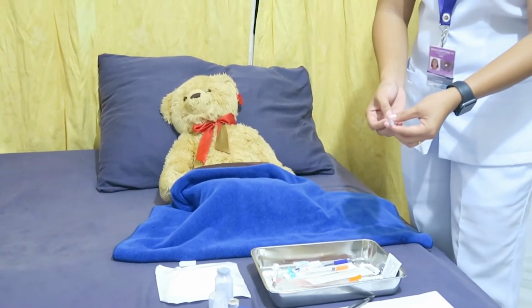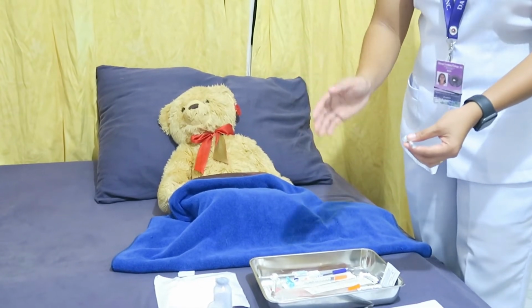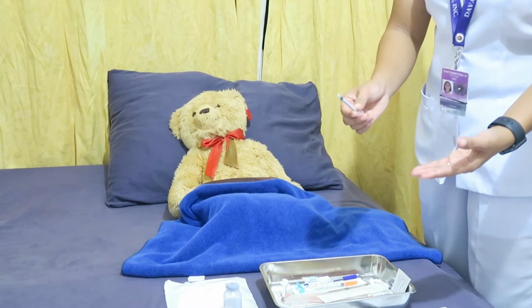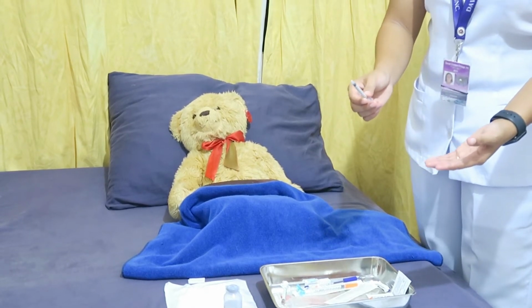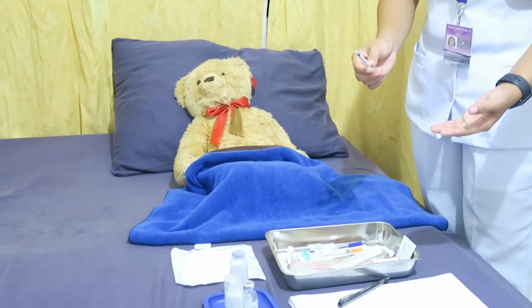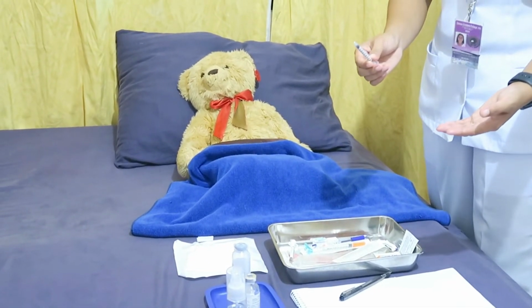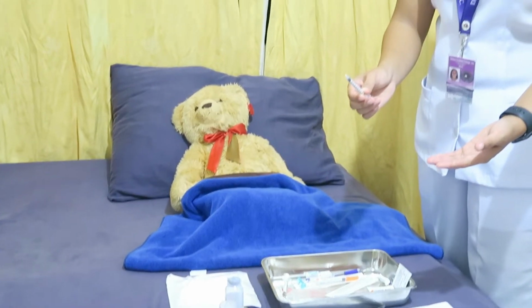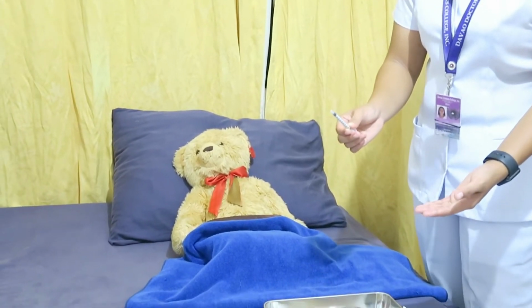So, the next is to inject the medication. Using the non-dominant hand, pinch or bunch the skin at the site and insert the needle using the dominant hand with a firm, steady push. The rationale for that is this pulls the fatty tissue away from the muscle and makes the injection easier.